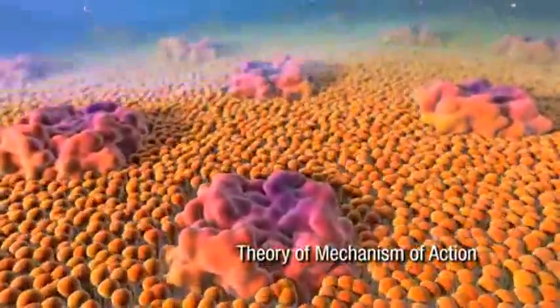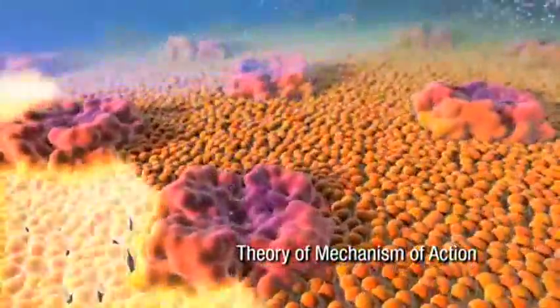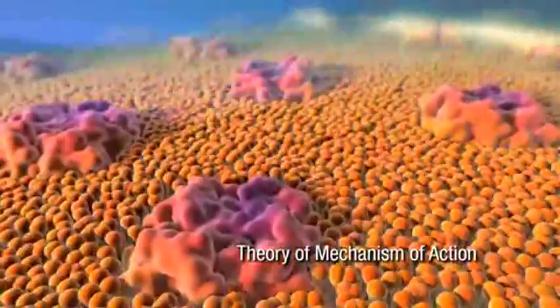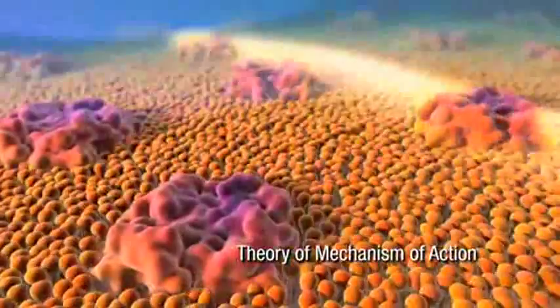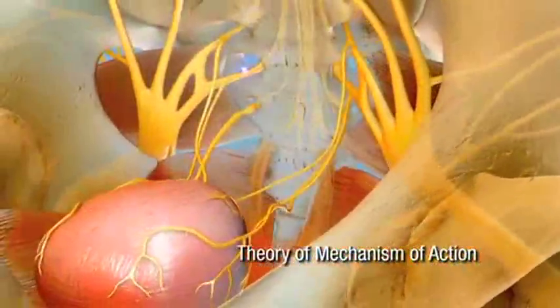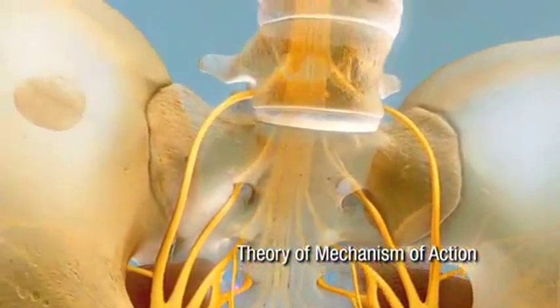This stimulation likely depolarizes the nerve, causing an action potential that propagates impulses along the axon as if the neuron naturally fired an action potential. As a result, it is thought that abnormal sensory input from the bladder is modulated.